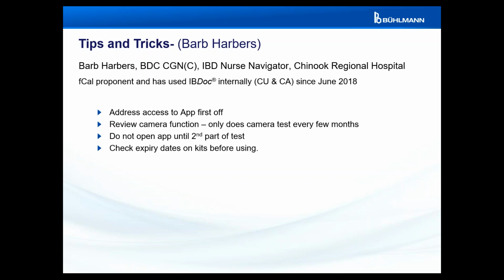And so at that point, I let them use their IBDoc. And if it tells them it's normal, it gives them a different sense of how they should treat what's going on. And then we can still have a conversation about it for sure, but it does give them a better idea of what's actually happening within their own body. People have been very keen to do it, to the point where I've had patients go out and buy new phones so that they can get onto this program if their phone didn't work.